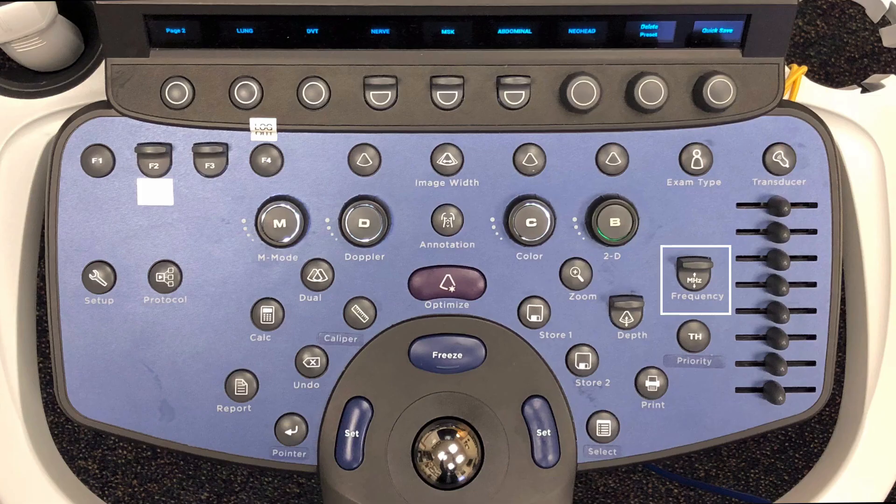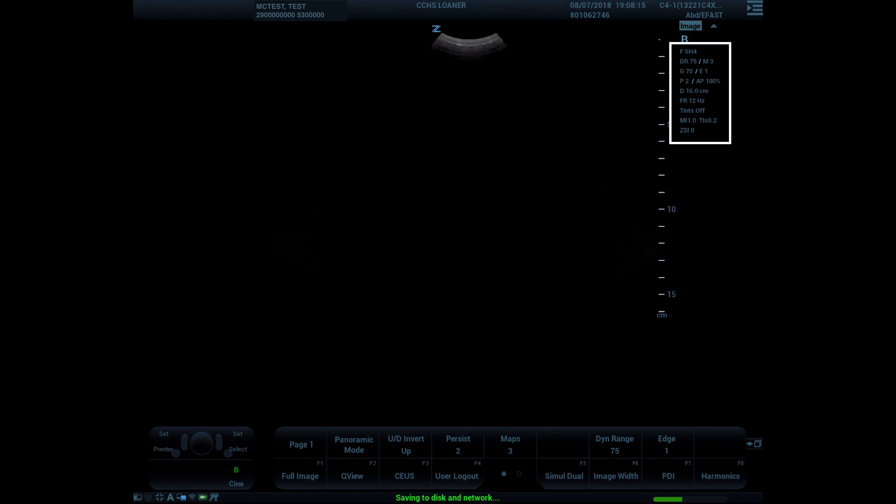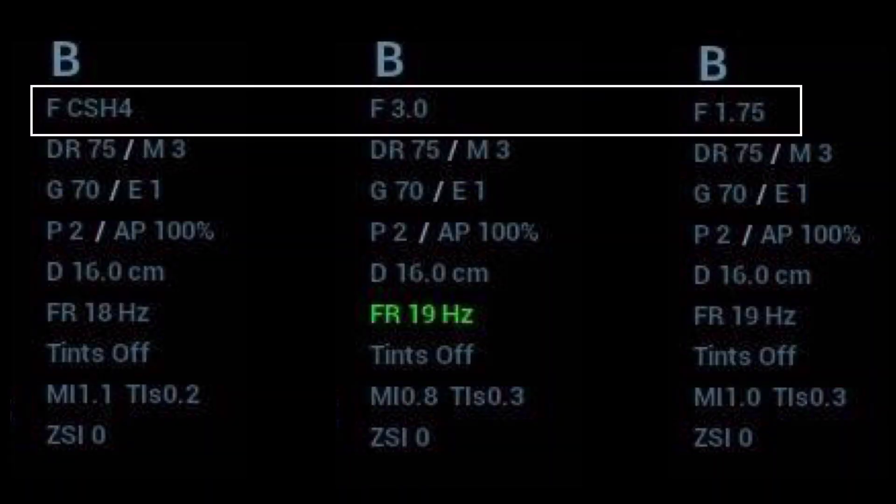Let's review how to adjust frequency on the system. Frequency is changed by toggling up or down on the frequency toggle button — go up to increase frequency and down to decrease frequency. The order takes into account fundamental frequency, spatial compounding, frequency compounding, and harmonics. The frequency and processing information is displayed in the right-hand corner of the image along with MI and TI information from the output display standard. The frequency information shows the fundamental frequency used and what additional parameters are engaged, such as compounding, spatial compounding, and H for harmonics. So while the fundamental frequency may not go in consecutive order, the order of frequencies displayed is correct as you go from high to low while toggling the button.